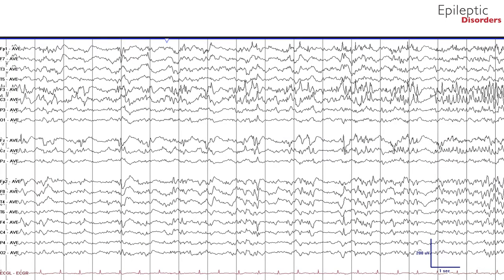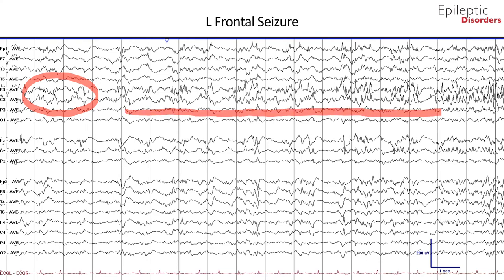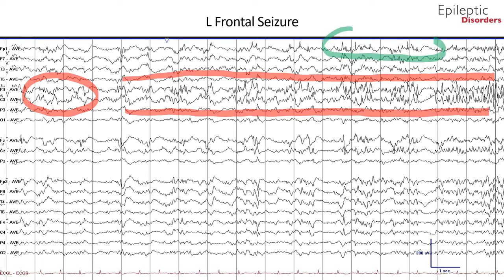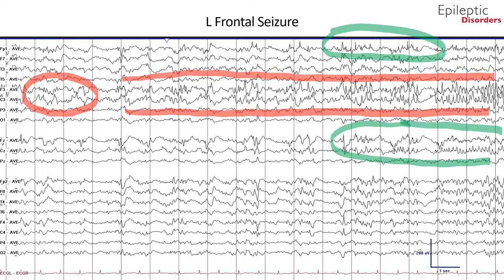In the same page shown in average montage, the field is clearly appreciated with activity of sharps beginning in the left frontal and central F3 and C3 region and evolving in frequency from 1 to 8 to 9 Hz. The spatiotemporal distribution is also well-defined in average montage, showing sharp waves in the FP1 region as well as increased sharp wave activity over the frontal and central midline channels FZ and CZ.